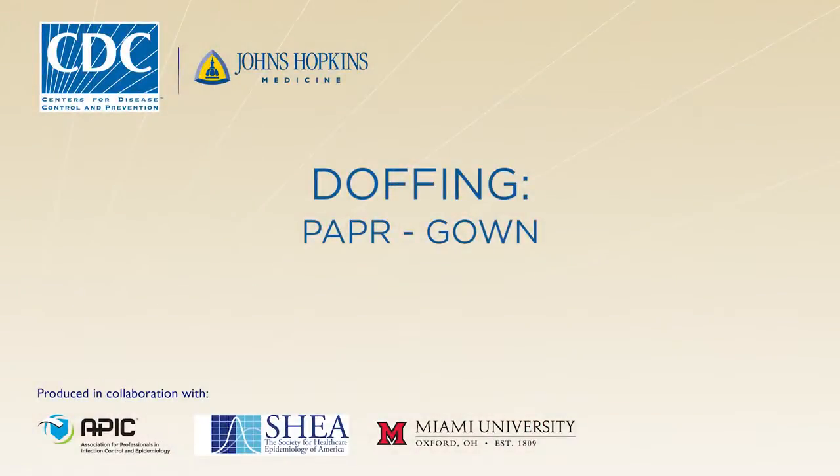So we hope you enjoy the training. And from our colleagues at the Centers for Disease Control and our colleagues at Johns Hopkins Medicine, we thank you for all you do for patients. In this video, you will learn how to doff or remove your personal protective equipment in accordance with CDC protocols. Following the doffing protocol will minimize the risk for disease transmission, so it's very important that you understand all of the steps.